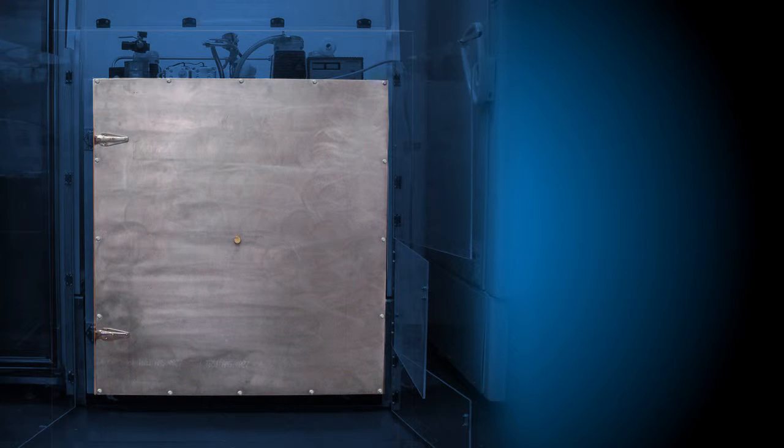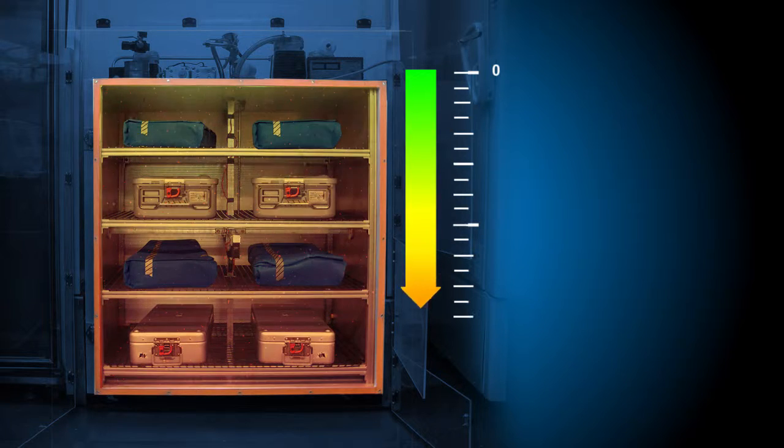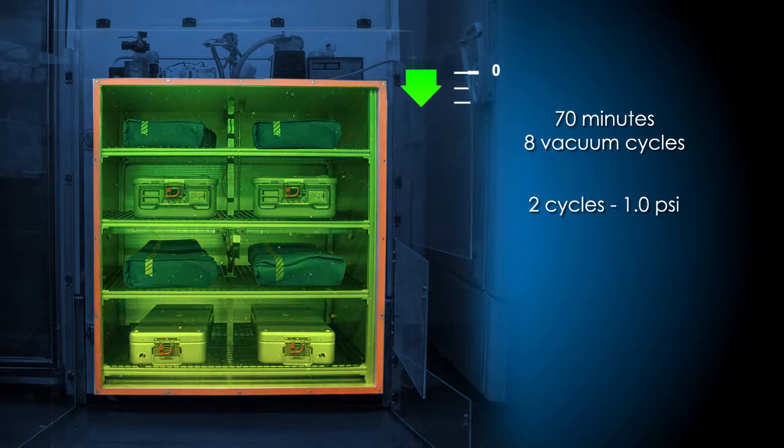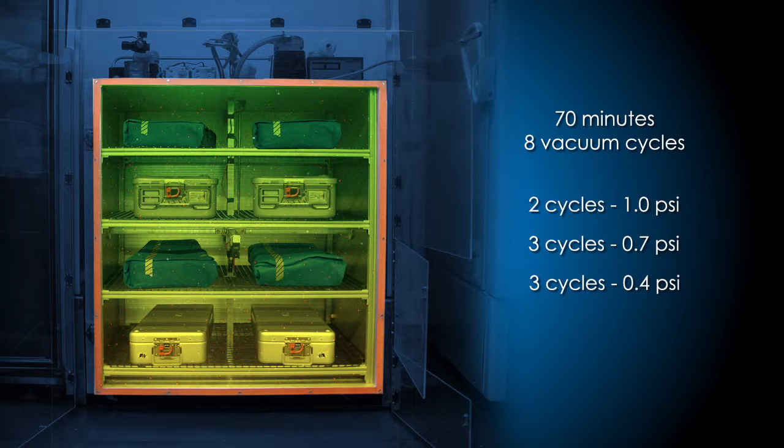Once the air inside the chamber was contaminated, a computer program controlled the chamber and its pressure changes. It took just over an hour for the packages to experience eight vacuum cycles — two cycles at 1 psi, three at 0.7 psi, and three at 0.4 psi. Bacteria were added throughout the test to keep the concentration of airborne bacteria at a relatively constant level.